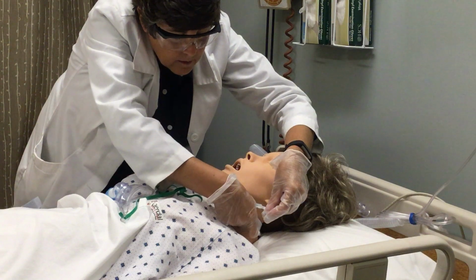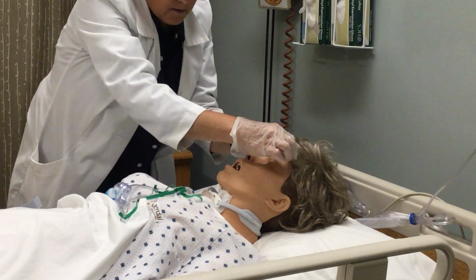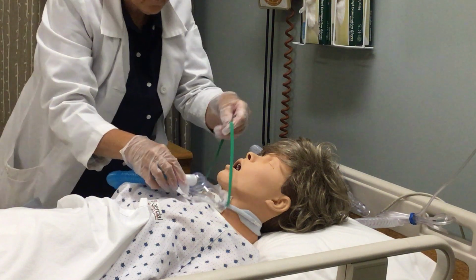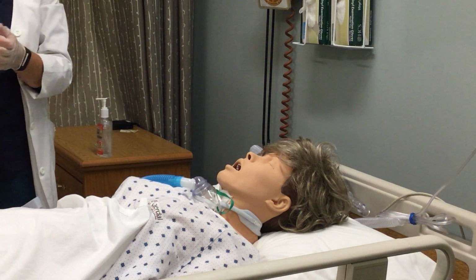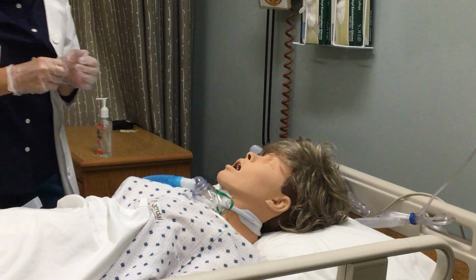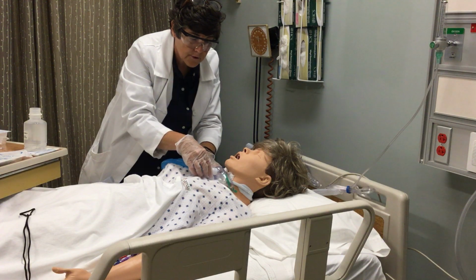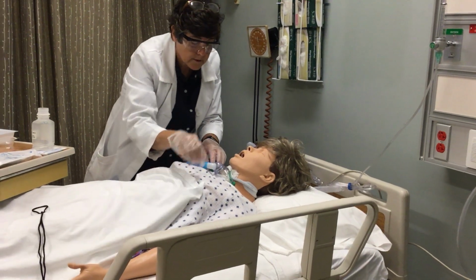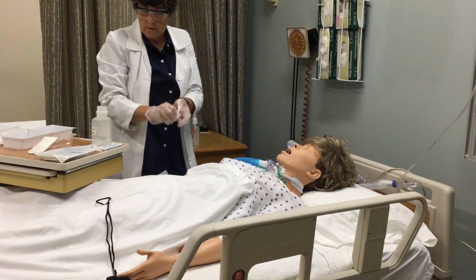Can get 2 fingers in here. Okay. Position the patient comfortably and assess his or her respiratory status. I'm going to replace her trach collar because that's her oxygen source. Also provide some humidification if she has really thick secretions.